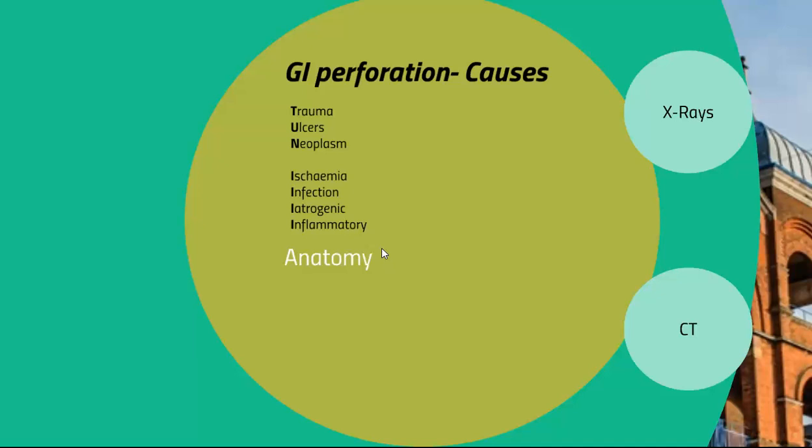When looking at a CT, the location of leaked intraluminal content, intraperitoneal versus retroperitoneal, can help localize the perforation site. If the leaked content, air or fluid, is retroperitoneal, think perforated retroperitoneal structures: D2, 3, 4, ascending and descending colon, or the distal third of the rectum. If the leaked contents are intraperitoneal, consider the other lumens.